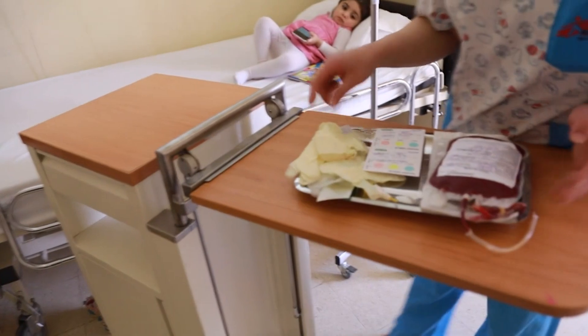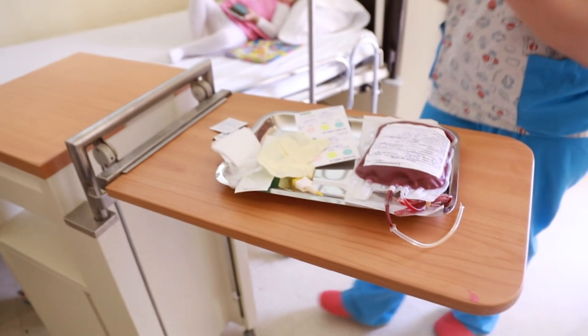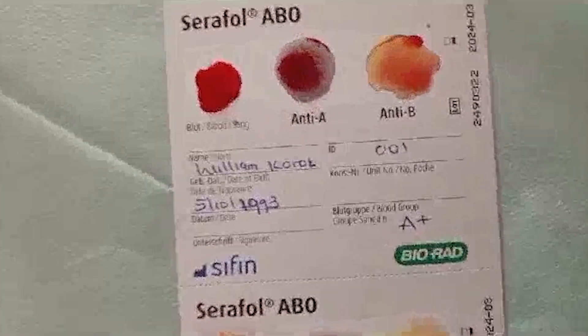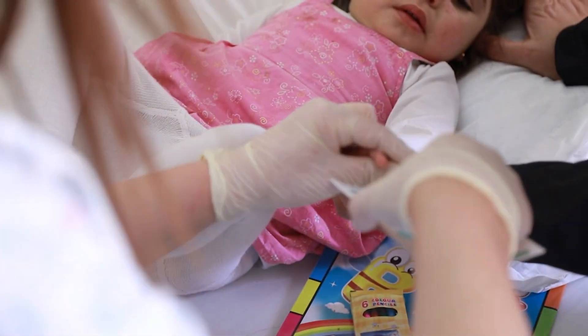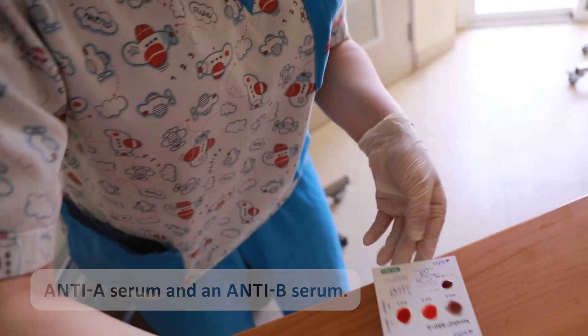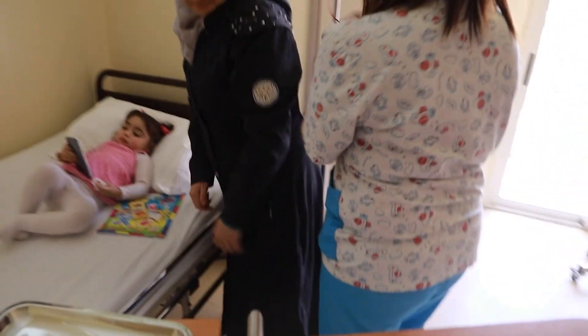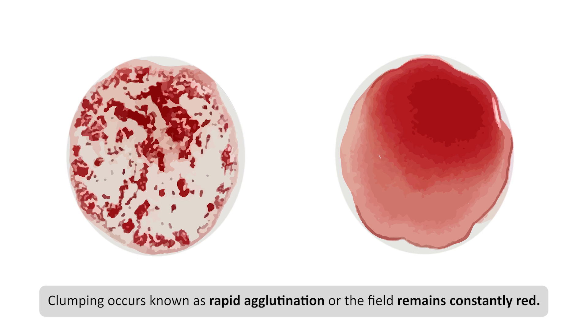The Serafol ABO bedside test is used in MSF to confirm the blood type and is usually used at the bedside immediately before a blood transfusion. The double card enables both the donor's blood and that of the recipient to be tested, meaning that any incompatibility can be safely ruled out. The test fields of the card are each provided with an anti-A serum and an anti-B serum. When the antibodies are mixed with the patient's blood, either a clumping occurs — known as rapid agglutination — or the field remains constantly red.